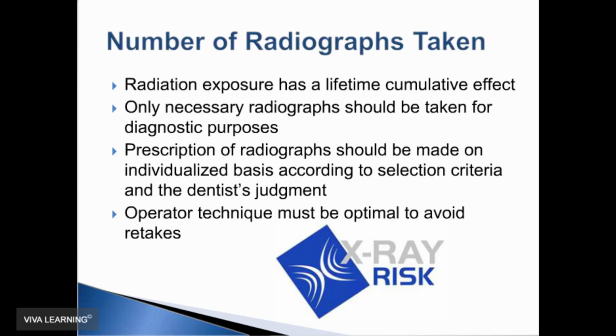We must remember that radiation has a cumulative effect. Recent research has documented that there's no dose of radiation that is considered safe, and that the risk is greater than what we once thought.